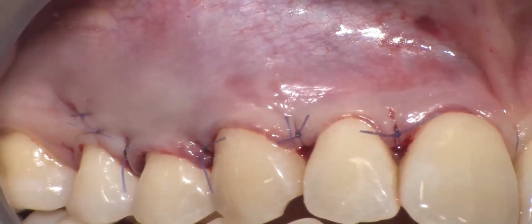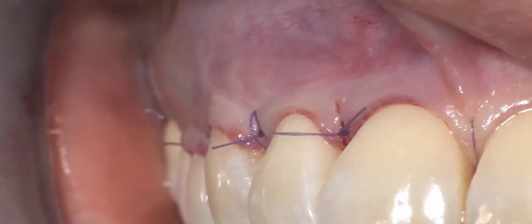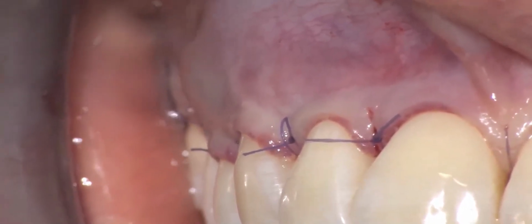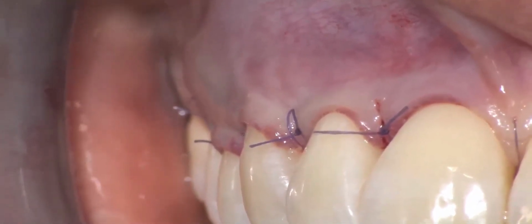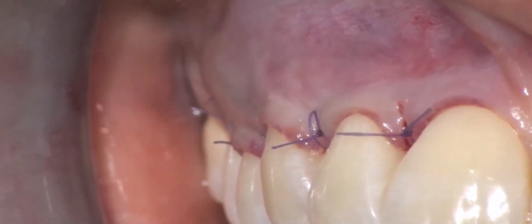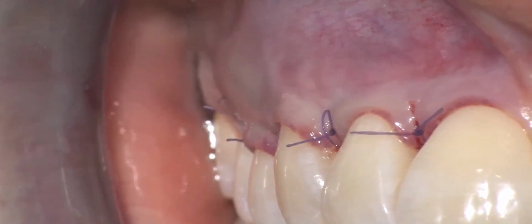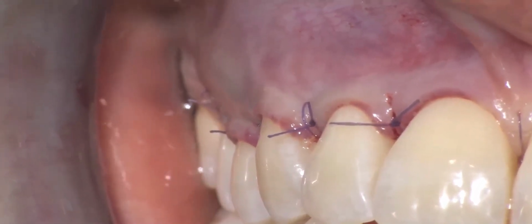Now I want to show you the profile of this area in order to better understand what I mean in terms of thickness. Both at the canine and the premolar, there is a big increase in blood clot below that will be organized in new connective tissue, while the lateral, since the recession was extremely small and there was a good quality of the keratinized tissue, it was not necessary to add the material.